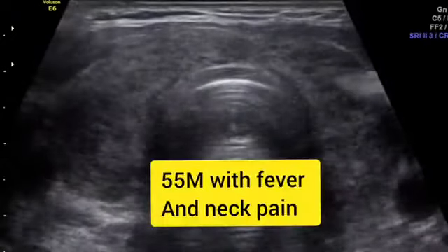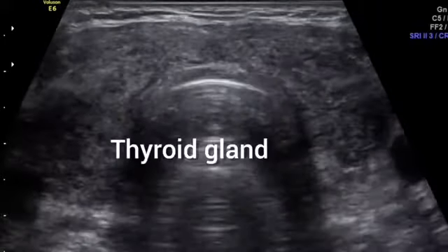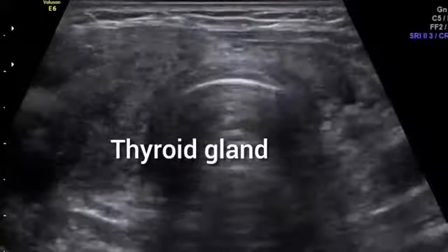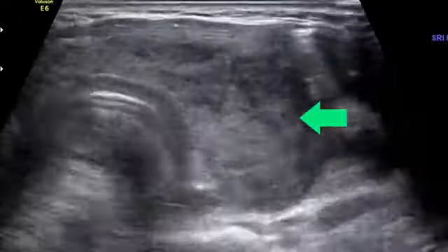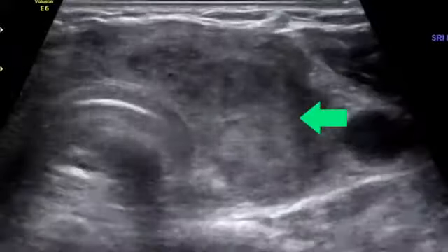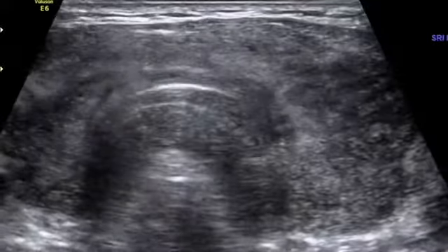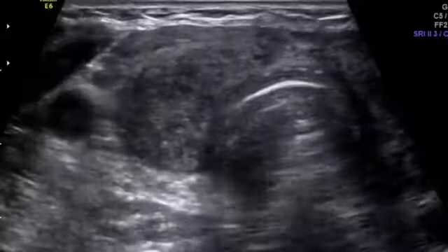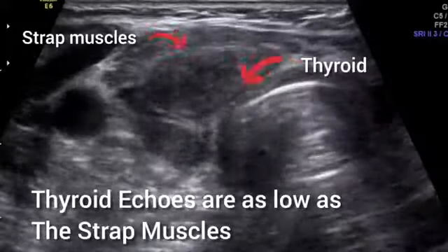The other pattern that we see is a change in the thyroid echo pattern. So let's have a look at this case. This is a 55-year-old male with fever and neck pain. And as soon as you start scanning, you see that the thyroid gland has lost its normal bright echo that we see. In fact, if you compare the echo pattern of the strap muscles to this thyroid gland, the thyroid echo is almost as low as the strap muscles.